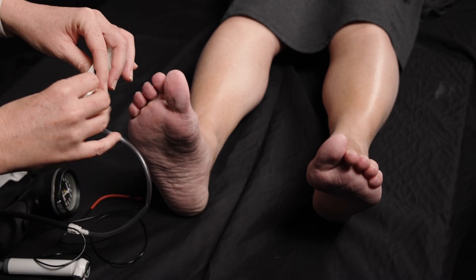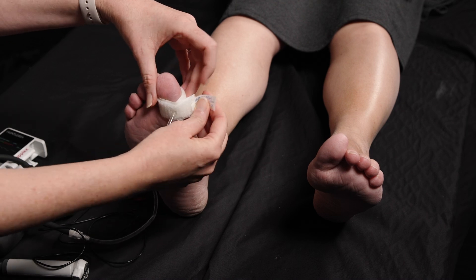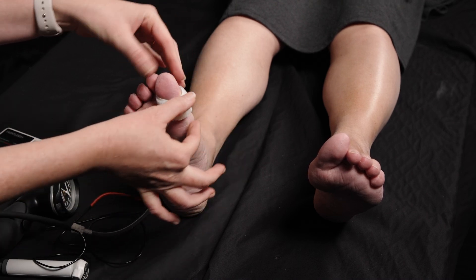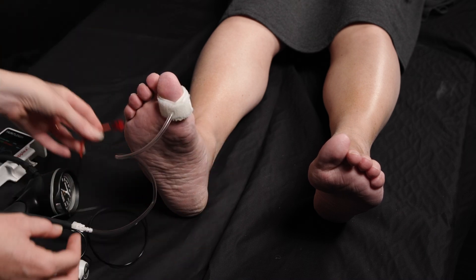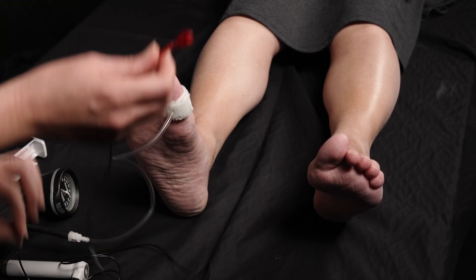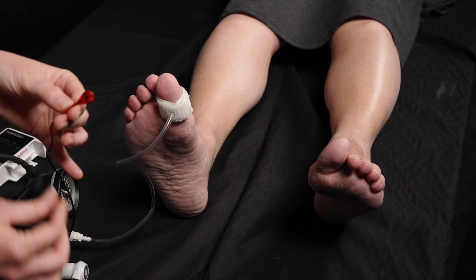which should go around the toe about 1.5 times, and it should be placed just very gently, so not too tight and not too loose. Then I'm going to place my PPG probe. So with this probe, this side will go to the toe.